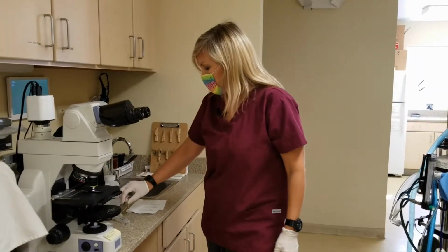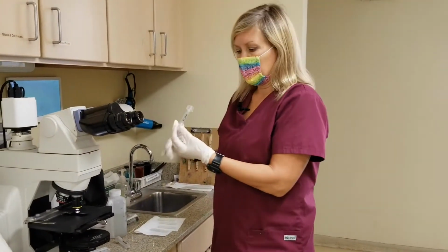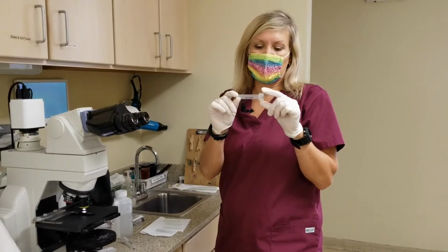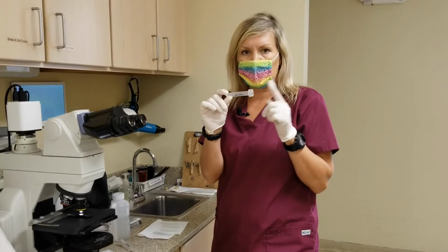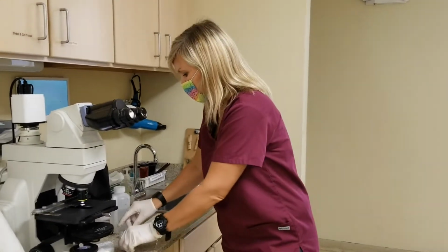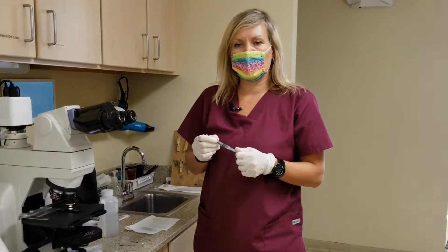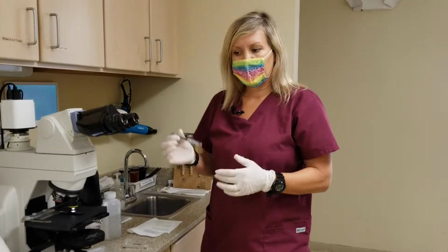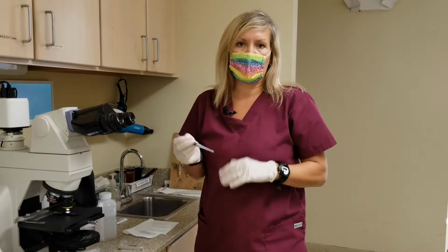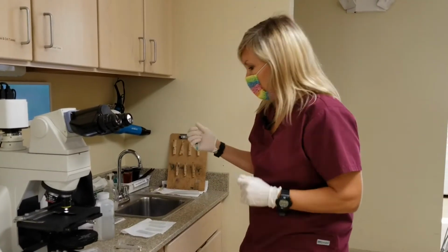So with our fecal, you don't need much to do a fecal. You need a microscope. And instead of using the expensive fecal containers, we actually use 1 ml and 3 ml syringe cases, which helps us conserve money that way. So they work really well. For our fecals here, we just do a direct and a float. Most of the parasites these animals have can be seen that way. Other parasites, you can spin them down to see better, but the ones that we most commonly see just come right up with the fecal float.